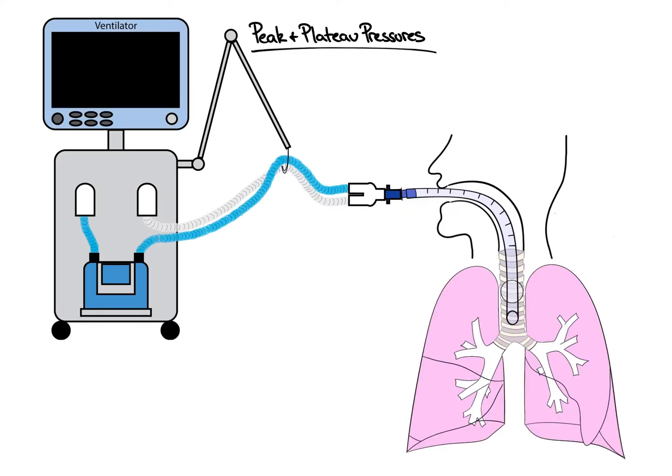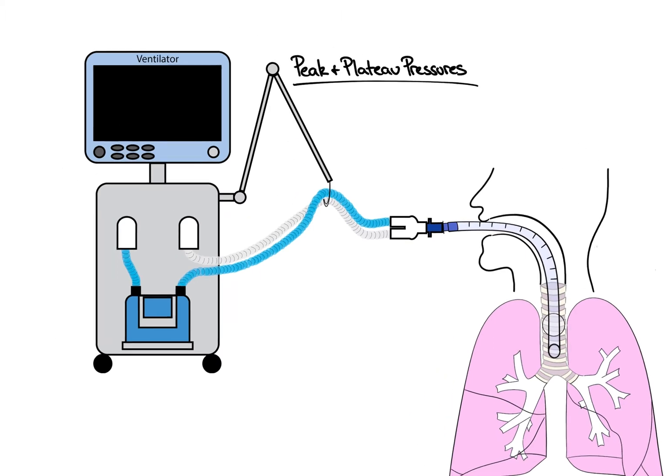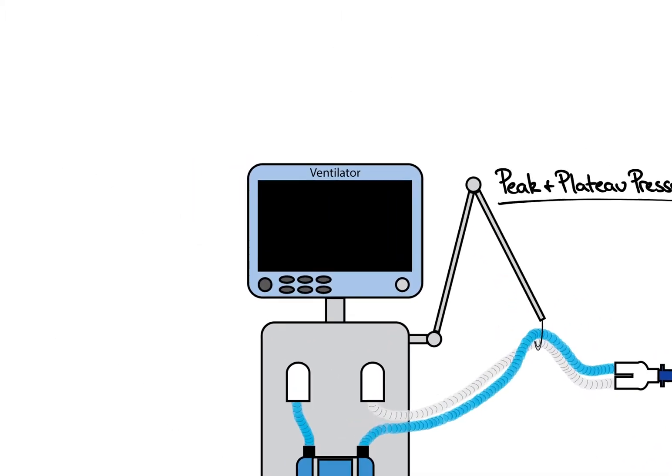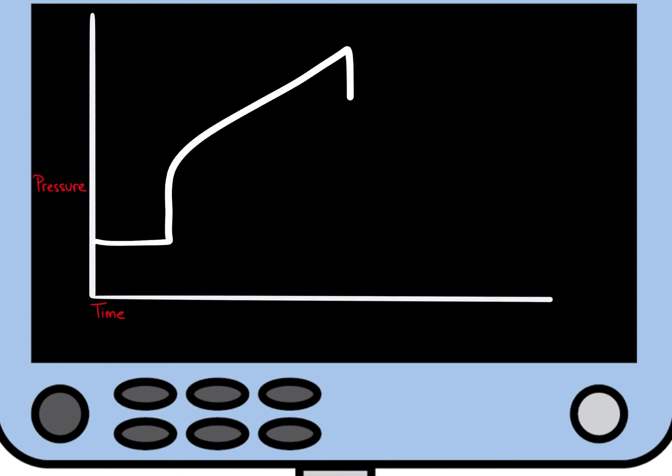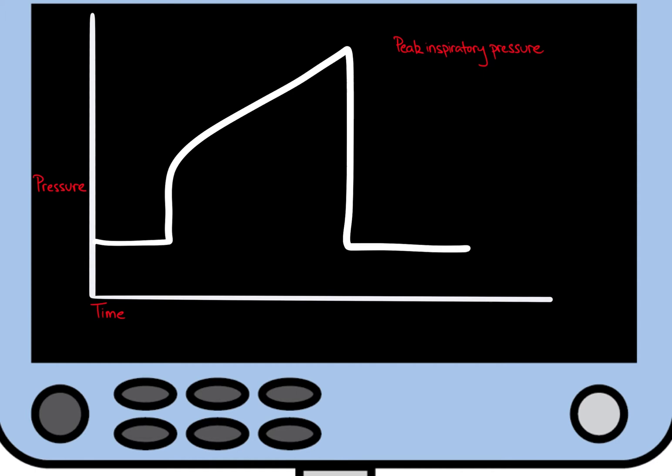Shown as an intubated patient requiring mechanical ventilation. First, let's talk about the pressure waveform on the ventilator. Shown as a sample pressure waveform for a patient on a volume control mode of ventilation. The peak inspiratory pressure is just that, the peak pressure at the end of inspiration.